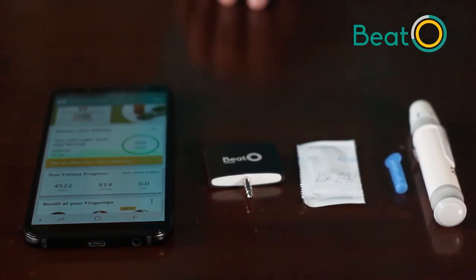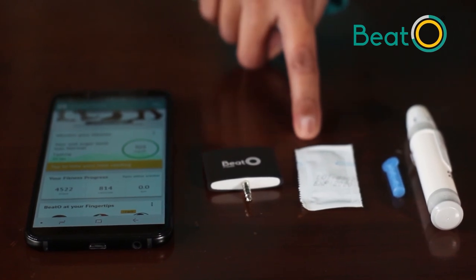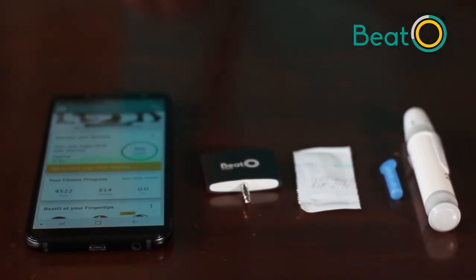To take your first reading, you'll need a smartphone or an iPhone with the Beto app installed. You'll need your glucometer, one strip, one lancet, and your lancing pen.